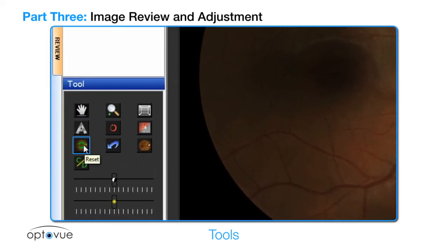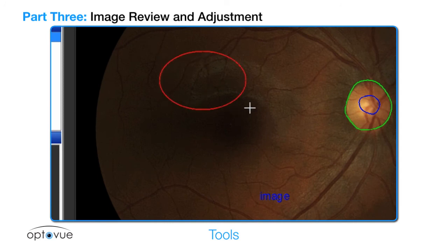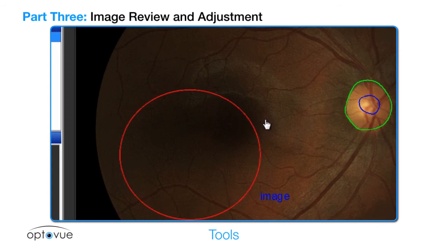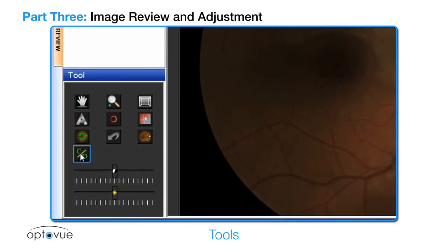The reset button returns the image to its original form. The red circle can be used to mark an area of interest. The CD button starts the process to draw the cup and disc. The two sliding scales below are contrast and brightness.